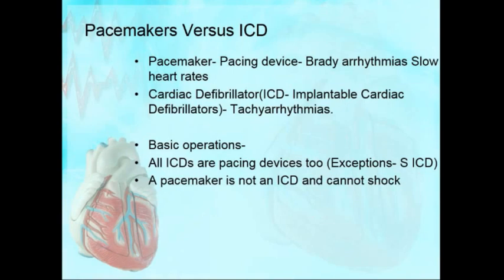Defibrillators are devices which, if something were to go wrong, recognize it and shock you back into rhythm. Okay? So defibrillators are used for tachyarrhythmias. However, defibrillators also have basic pacemaker function. So what it means is, everybody who has a defibrillator also has a pacemaker of some sort. Not everybody who says they have a pacemaker has a defibrillator.